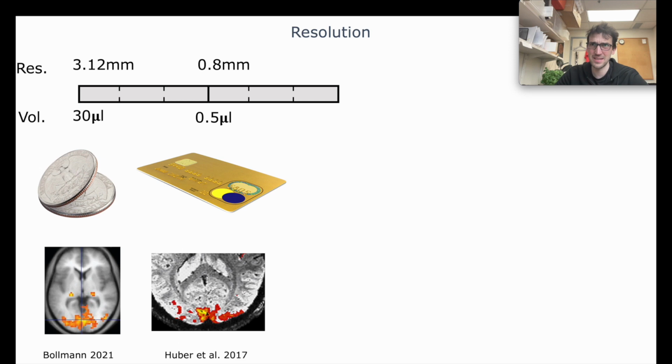I don't really believe that, and I think it's mostly coming from this hand-wavy rule of thumb that the TSNR or SNR is directly proportional to the voxel volume, which in a conceptual theoretical framework makes sense. I don't believe it in practice. I think it's rather misleading to have this law of voxel size directly corresponding to a resolution. It's a relative relationship, right? And there's no clear absolute value to that. There is no physical law out there that predicts the TSNR based on the voxel size. It depends on much more than just the voxel size.